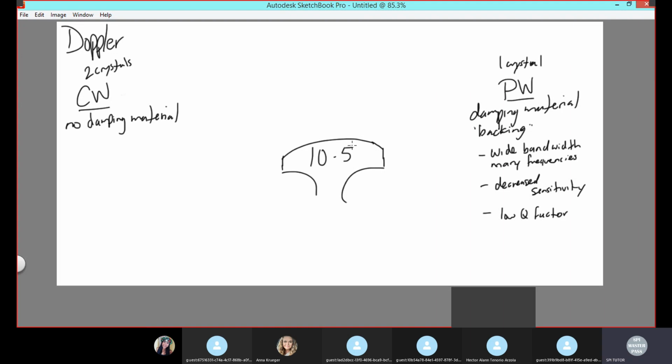Okay. And this is what allows us to change the frequency of our transducer and say, oh, this patient is heavy. Let me click penetration. Let me lower my frequency. Or, oh, I'm doing pediatrics.